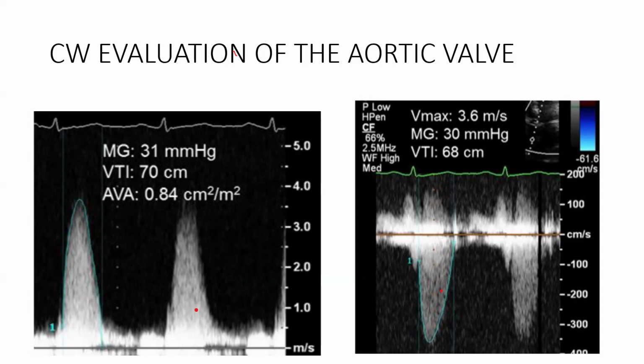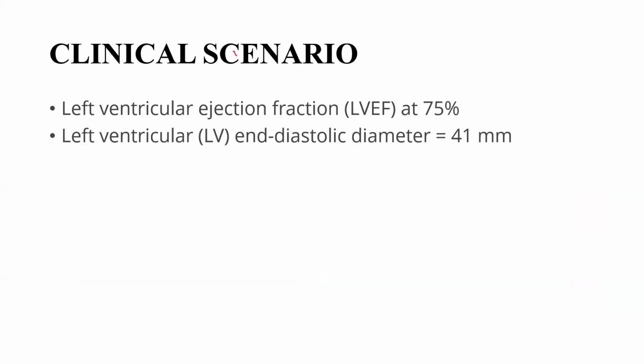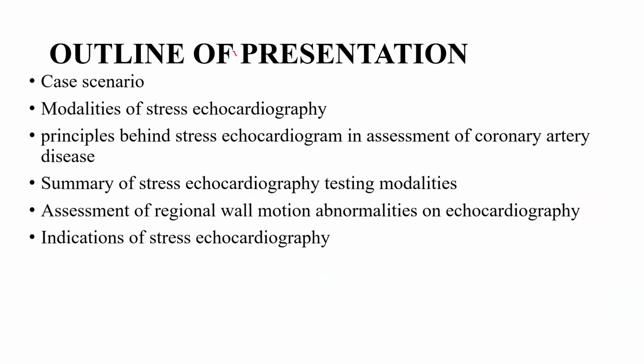Then the last one, sorry, I'm just wondering. I think there should be a way. You said for the bicycle, you can do it while the patient is exercising, unlike the treadmill, which is post stress. So I'm wondering, how will you do it? Do people actually do it? How will you do it as the person is cycling and you have a probe on the hand? It's not looking feasible to me. So just if you can explain.